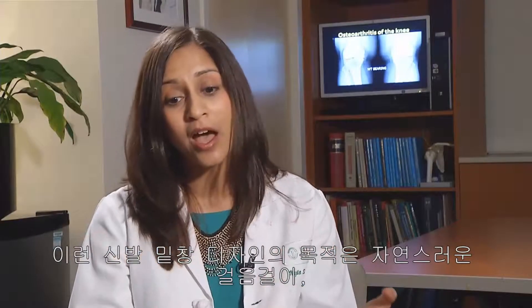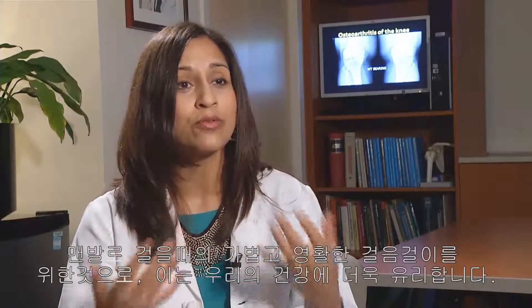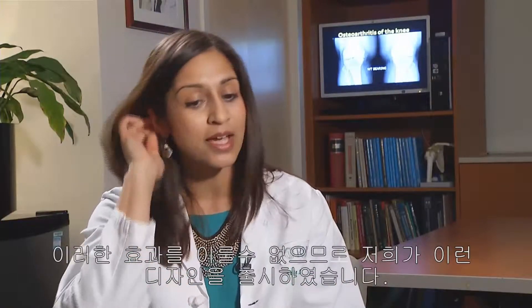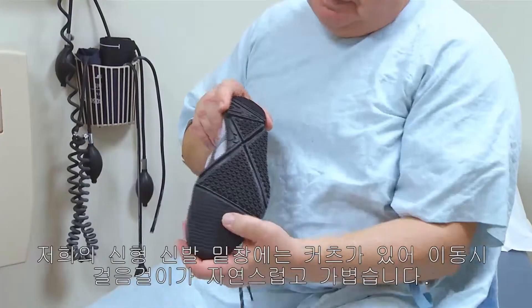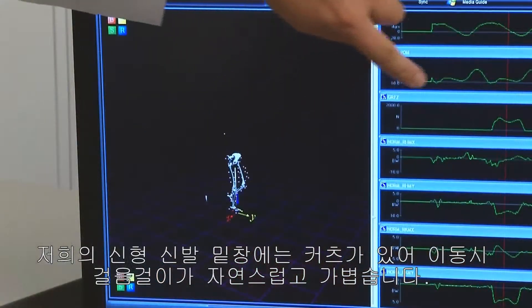This is how this shoe sole came about. We started thinking that perhaps natural movement — barefoot-like movement — the natural flexibility and gracefulness you get of your foot touching the ground is beneficial for us. And with modern footwear that's out there right now, we were losing that. So that's where this design came from. This new sole design has cuts in its sole that allow you to walk very naturally and very gracefully.